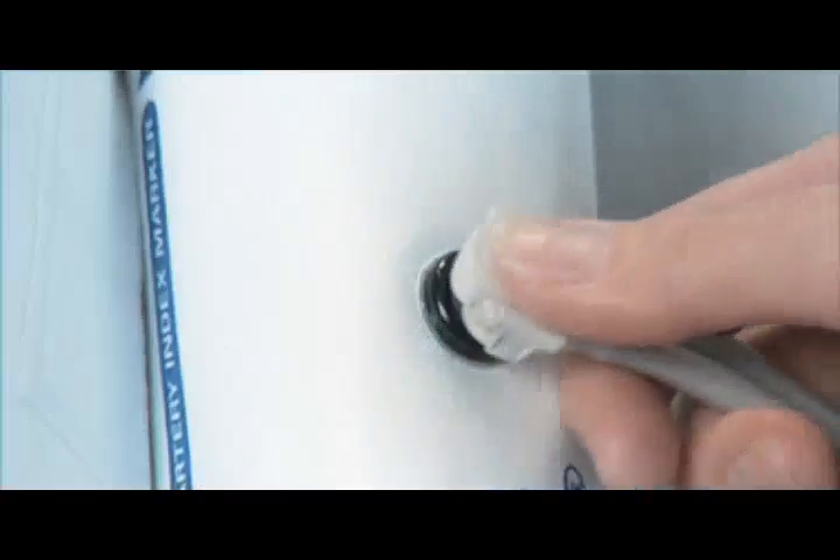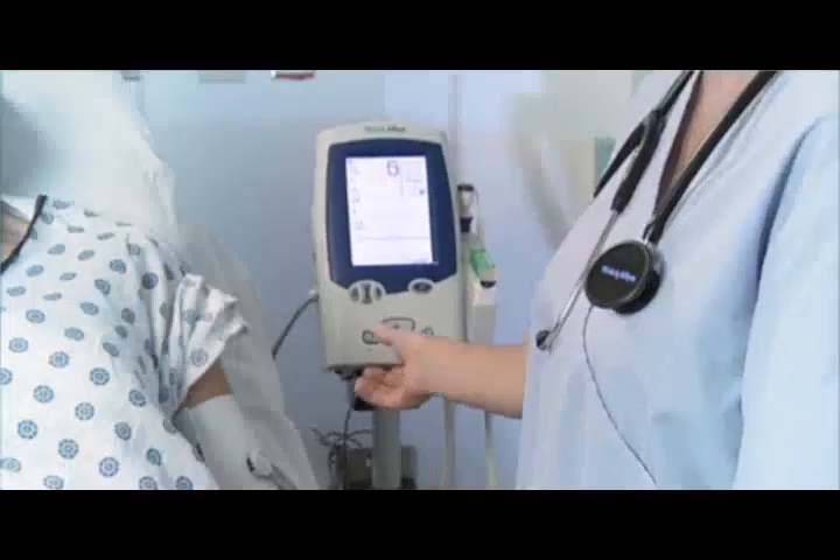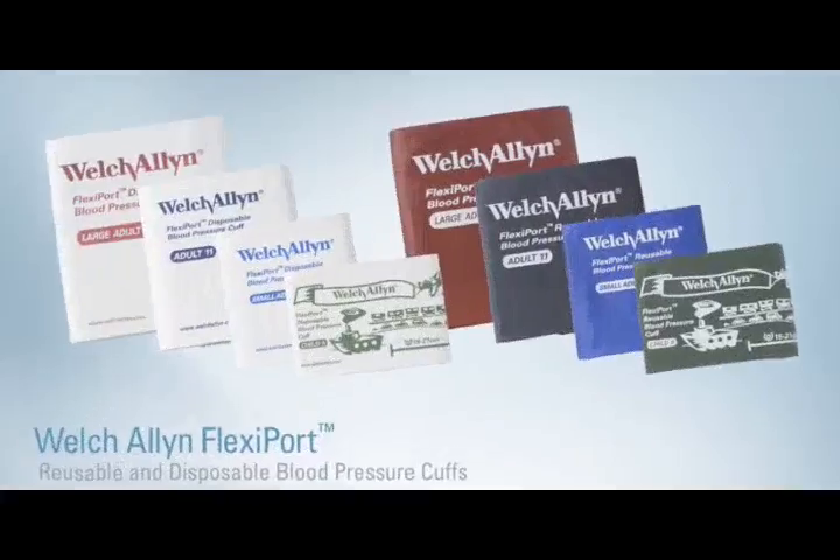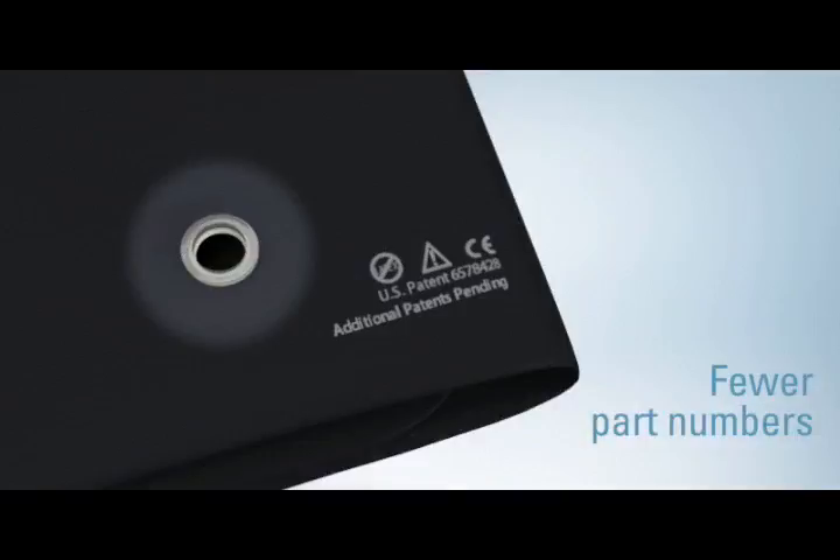Now there is a simple and truly standardized solution: Welch Allyn FlexiPort blood pressure cuffs — the first blood pressure cuff with a single point connection to reduce cuff complexity.